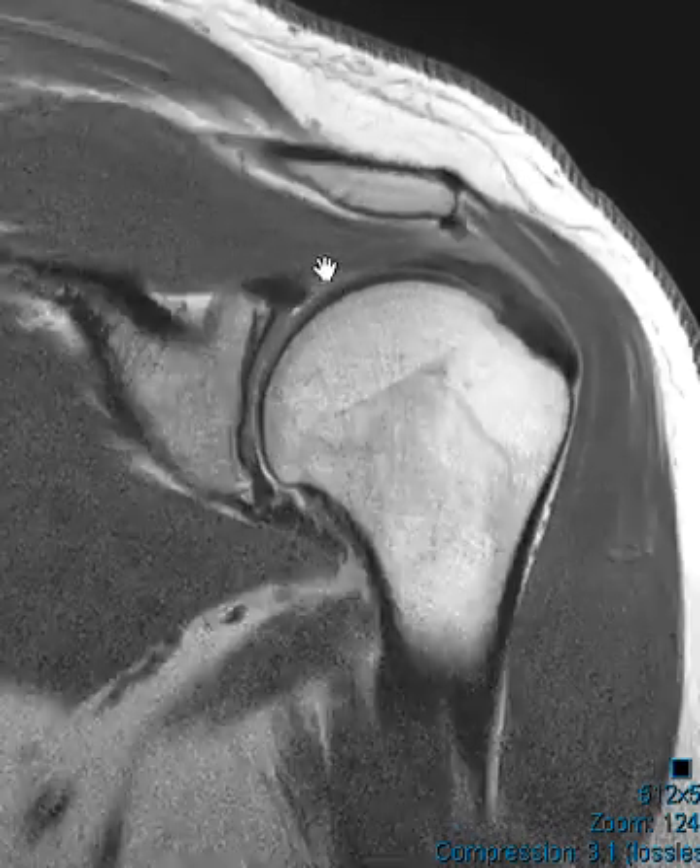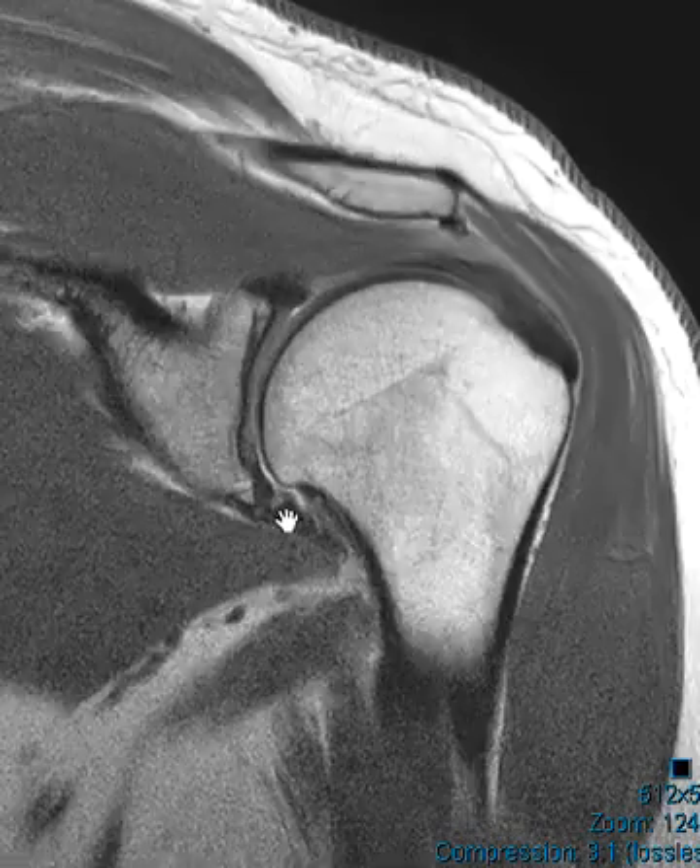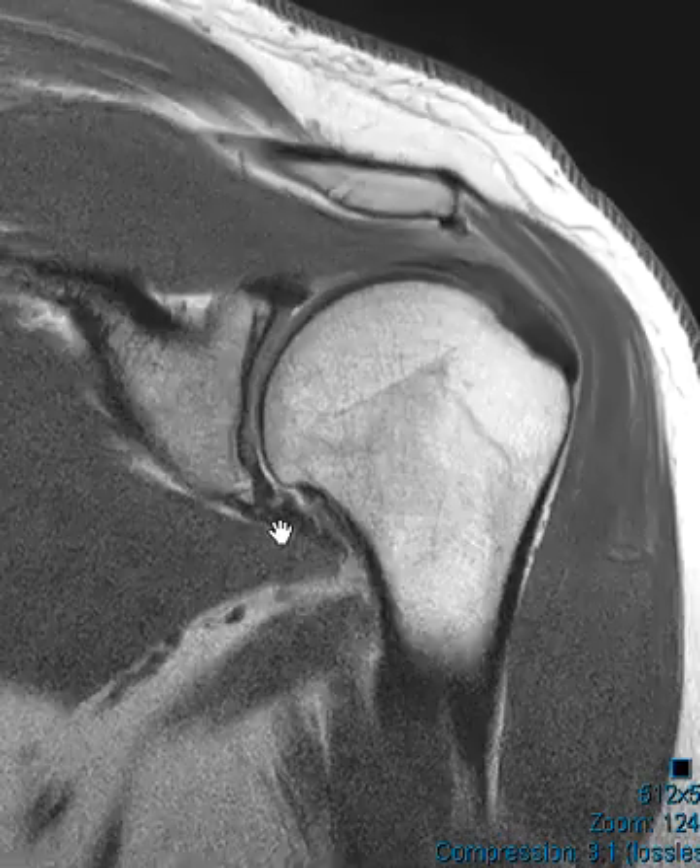Looks like a T1-weighted sequence. And we look at the labrum here — this is the superior labrum, inferior labrum. The inferior labrum does look a little funny here, so we're going to look at that in another view.